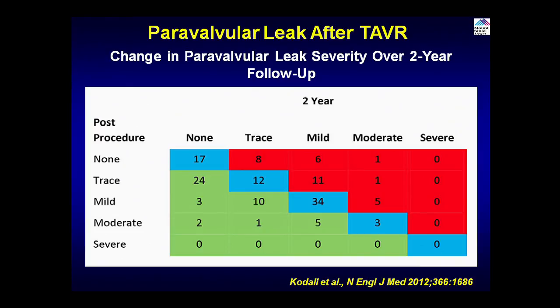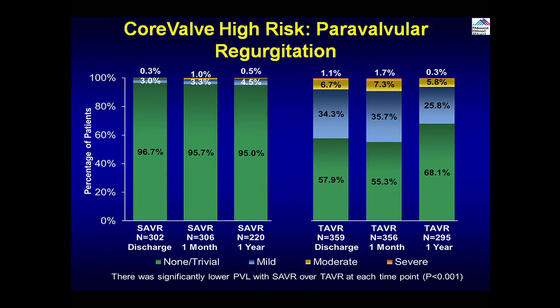Next. And this is a separate depiction of the same. What you leave at time 0, it usually will decrease. Rarely the regurgitation we leave at time 0 increases, but usually it decreases, or remains constant.